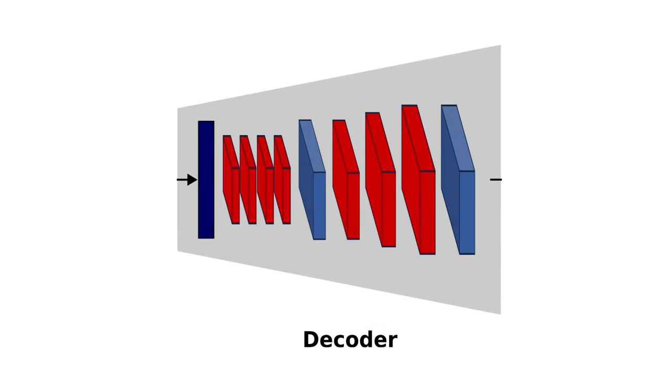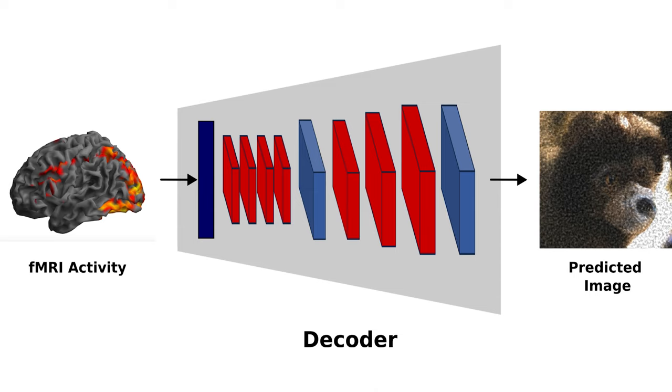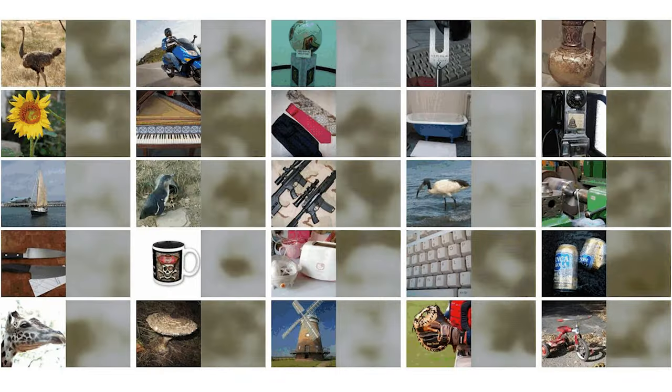Next, we train another ML model called the decoder by turning the encoder model on its head. Now, if we give the decoder fMRI activity, it must reconstruct the viewed image pixel for pixel. In this experiment, our participants viewed a sequence of images while we recorded the functional MRI scans of their brain. Then, we tested two of our deep learning models, which have been training for a while now. On studying these scans, our model generated an image of what they understood could have evoked the particular response in the participant. How well do you think our model did on its task?